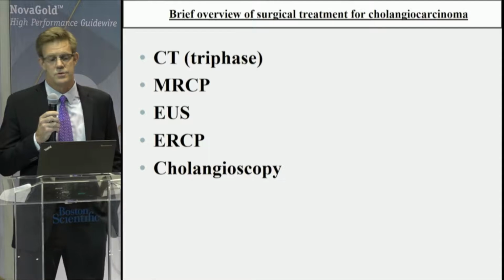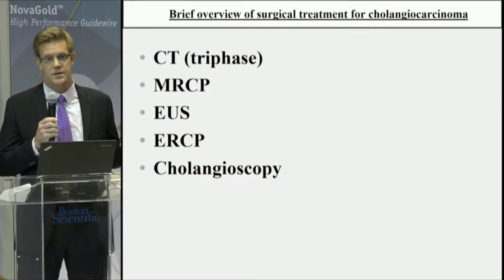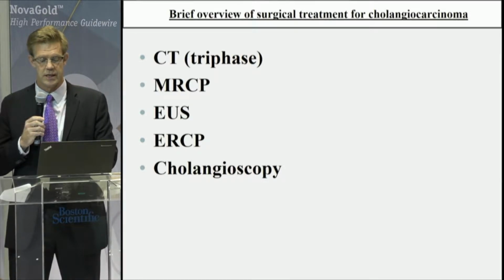So traditionally we've used CT, triphase CT, MRCP, EUS, and ERCP to work these patients up preoperatively, gauge the extent of their disease, and make a diagnosis. More recently, as we'll talk about today, we're using cholangioscopy.